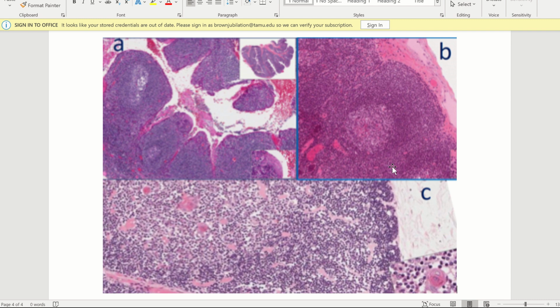This one right here, this is that same picture we keep seeing. We've got these afferent lymphatic vessels on the outside. We've got the capsule, and then out here towards the outside, we've got this kind of round looking thing. So this is a follicle, and I know it's a follicle because it's towards the outside, it's in the cortex. It's got this germinal center, and that's very characteristic of a lymph node. They've got these follicles in their cortex towards the very outside of the organ with these germinal centers. And then we've got these hot pink high endothelial venules in this parafollicular area.